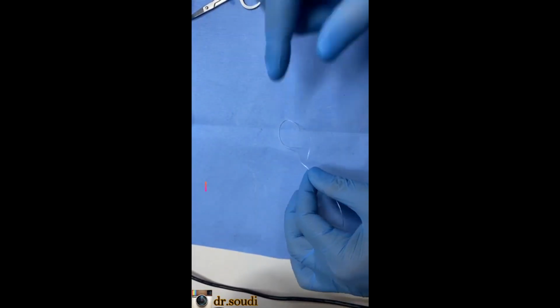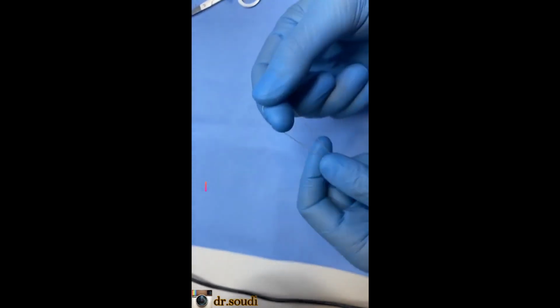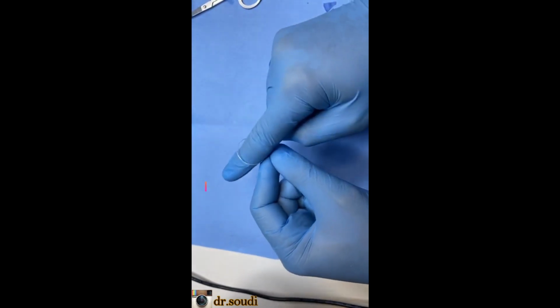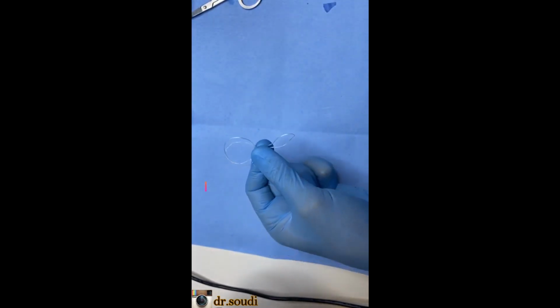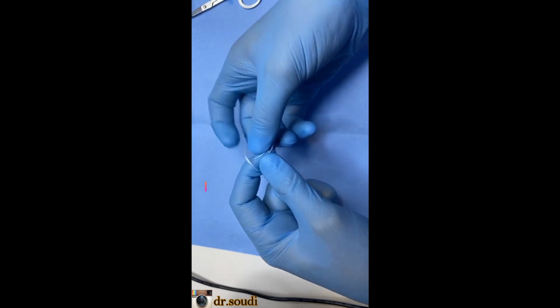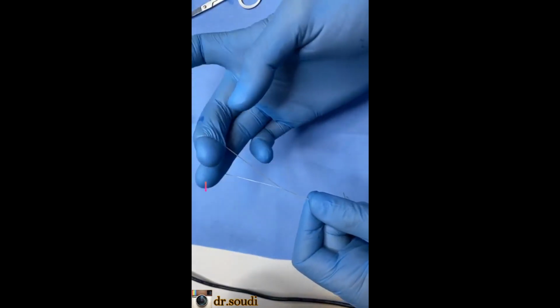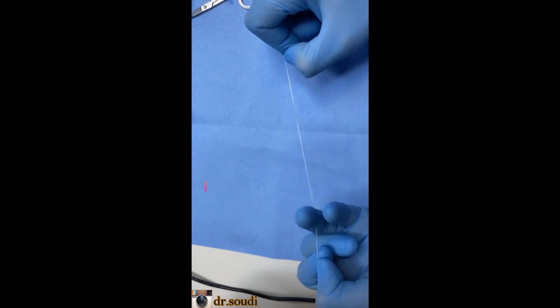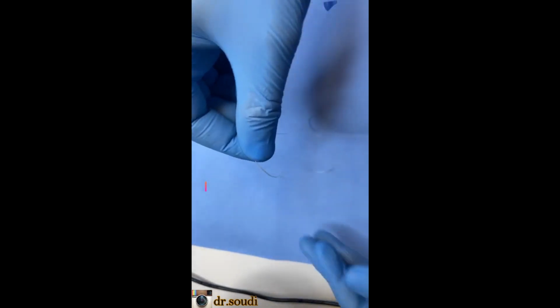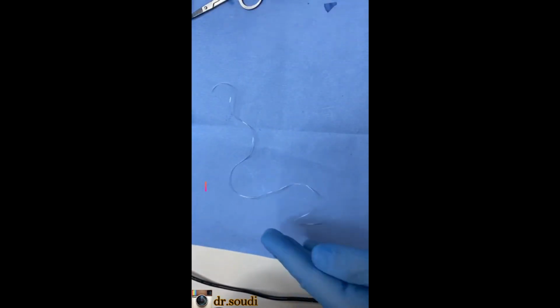Is there another way to make the single tie? Like a hanging one, like this. Now you have a hole, this one from downward inside the hole like this, and you got your hang, you got your tie. You press it, this is your tie, the tie you need. The most important tie I use, the 2 ties. We will do it and we are finished today.